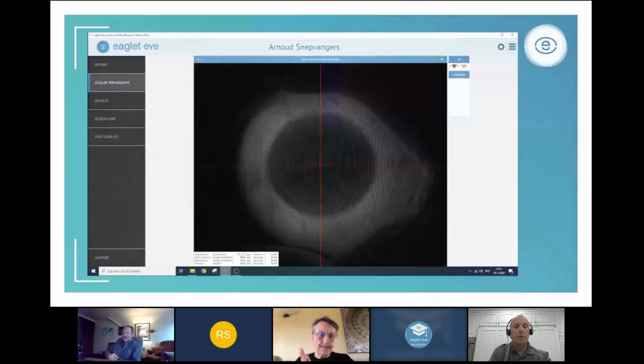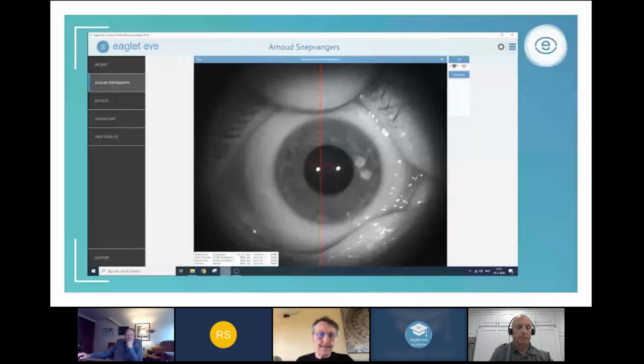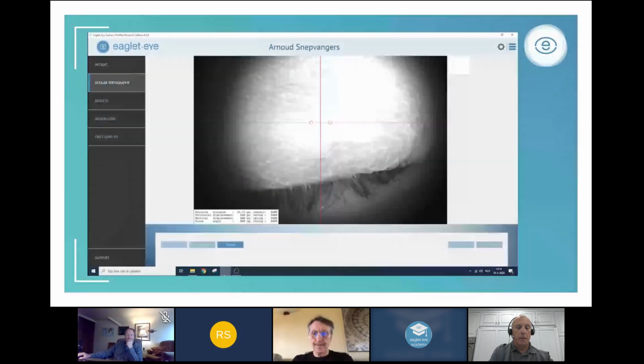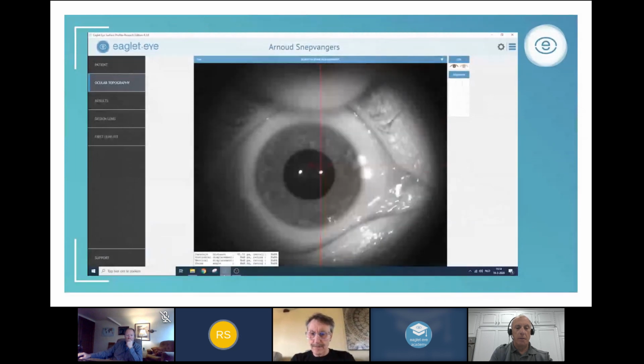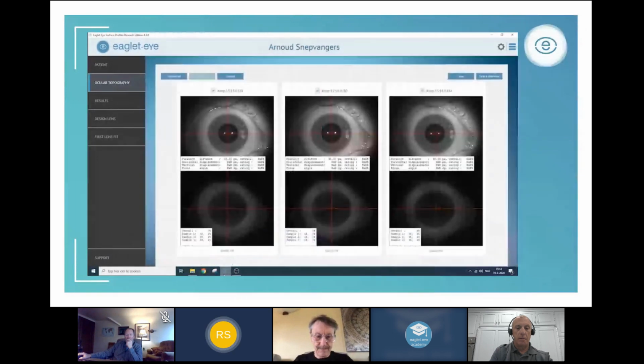Yeah, okay. Actually this video is about 30 seconds, and in this 30 seconds, 3 images are taken. So what you see happening is we have a second person yanking open the eyelids. The operator is taking the image. So the image acquisition itself is very fast. It's just a split second. It only takes time to prepare the patient and instill the fluorescein, and that's most time consuming.